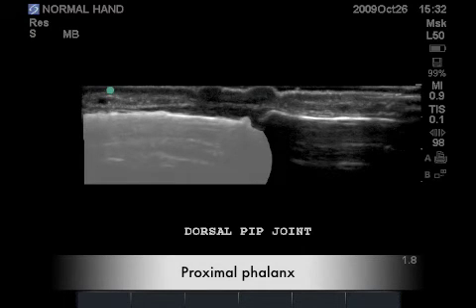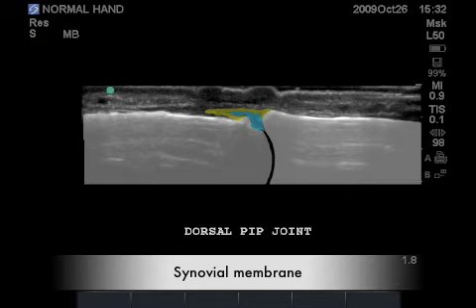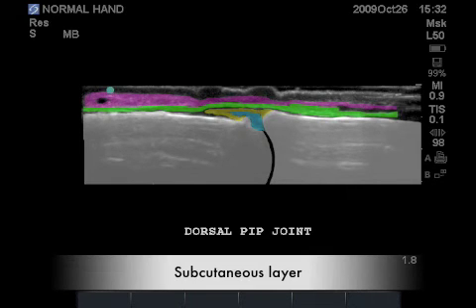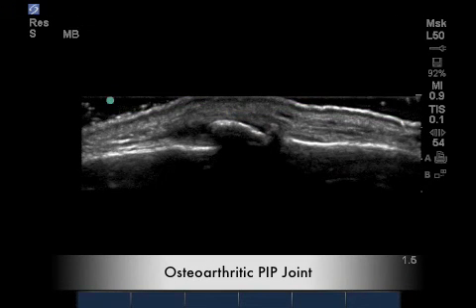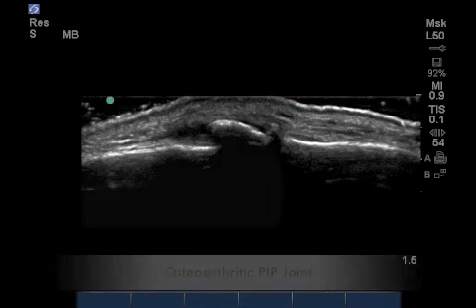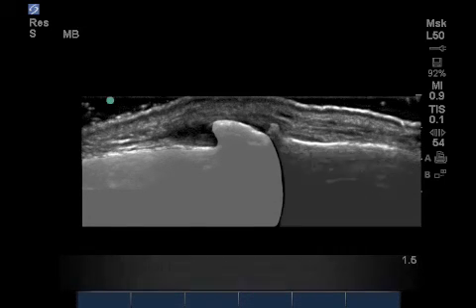Highlighted here is the proximal phalanx, followed by the middle phalanx and the normal physiologic fluid, followed by the synovial capsule, highlighted here in yellow, and the extensor tendon, highlighted here in green, the subcutaneous layer in purple, and the orange cutaneous layer. When evaluating osteoarthritis, the primary changes are observed in the cortical surface rather than the synovial lining.